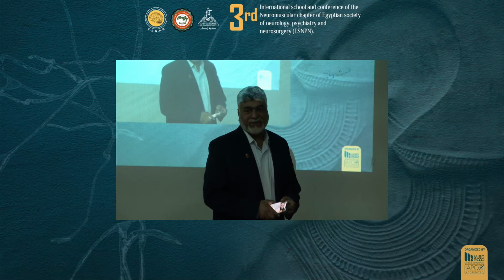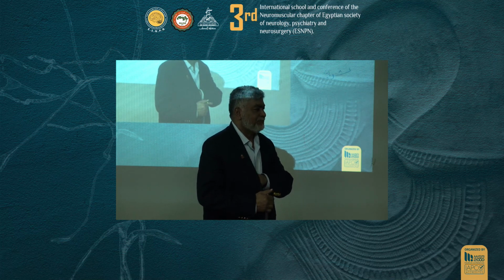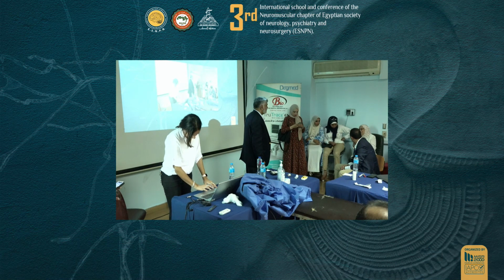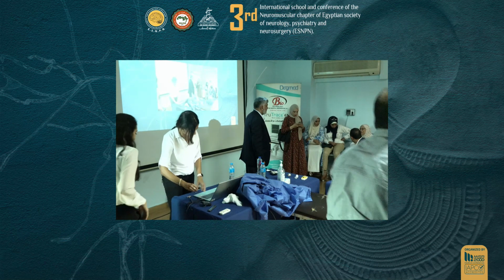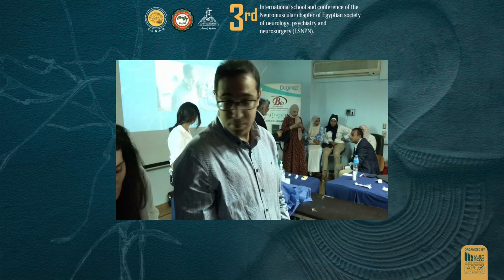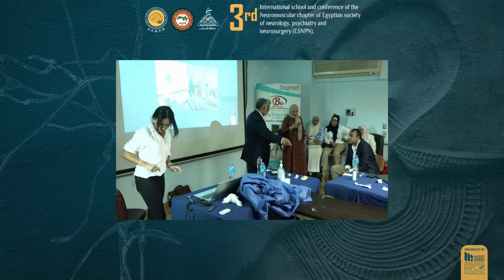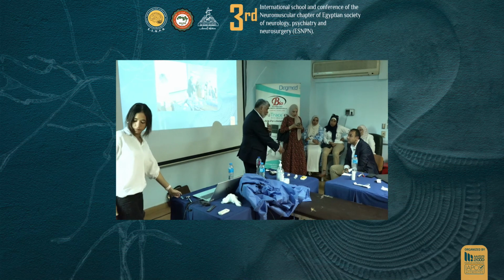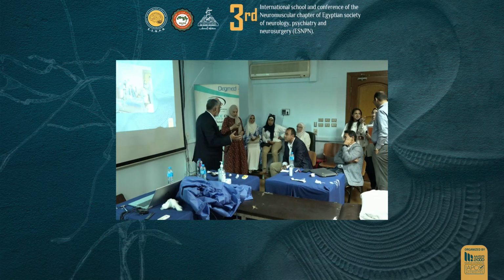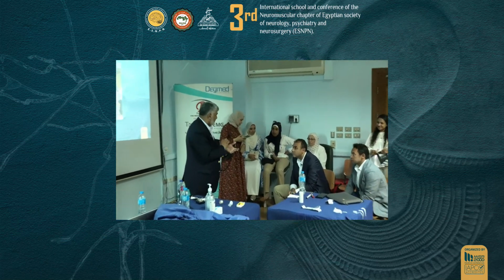Last question. Okay, the distal muscular dystrophy. Sometimes it is not diagnosed easily, especially if there is very chronic denervation. Recruitment pattern, I told you, all day. You saw this patient right in front of your eyes. Then if you do an MRI, I can guarantee you, it's all fibrous. When I put the needle in there was no muscle. I actually hit bone. So, very thick, I told you, right? It's very thick, it's all fibrotic.